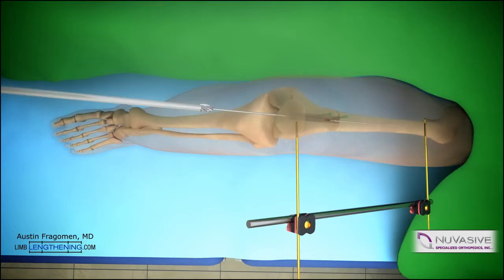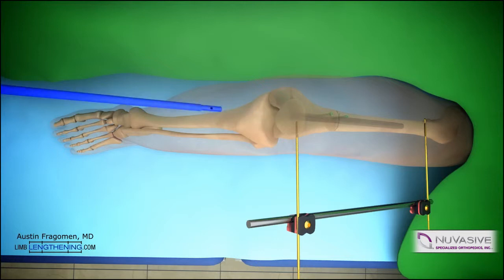A ball-tipped guide wire is then inserted in the path that was already pre-reamed, and then down past the osteotomy site. Sequential reaming is performed with flexible reamers in a standard fashion. We recommend reaming 2 millimeters over the diameter of the precise nail. The nail is then inserted.